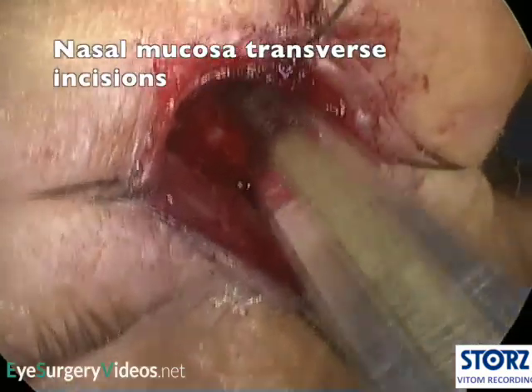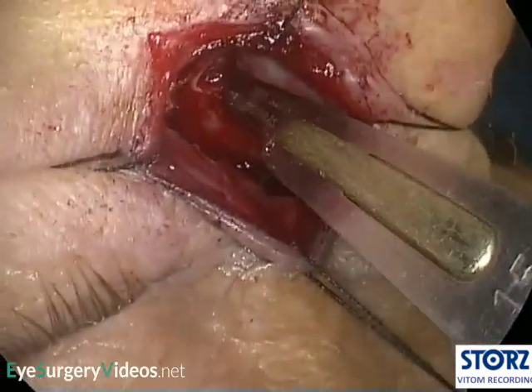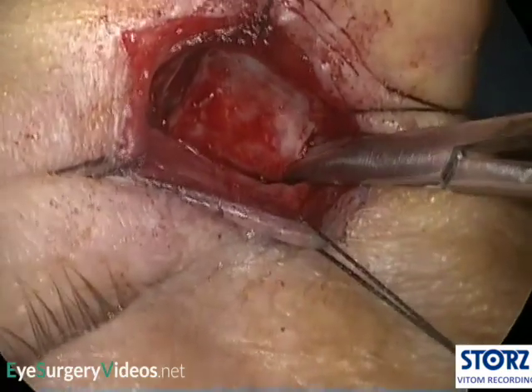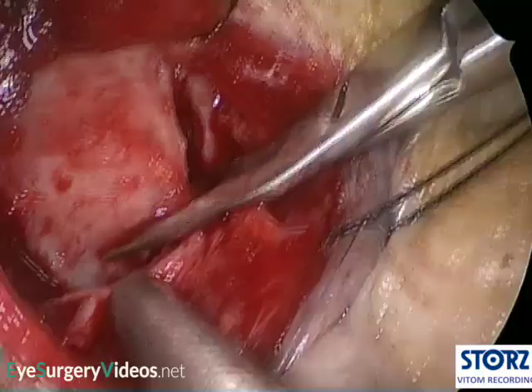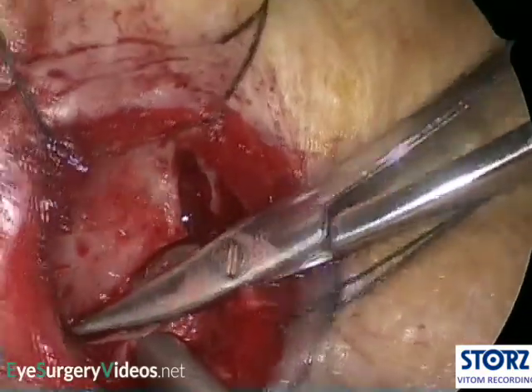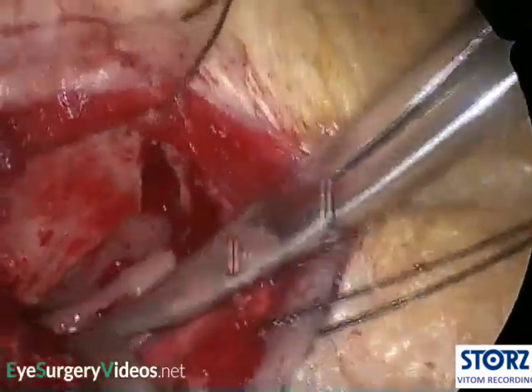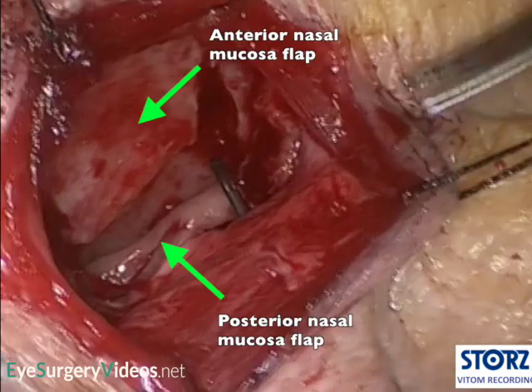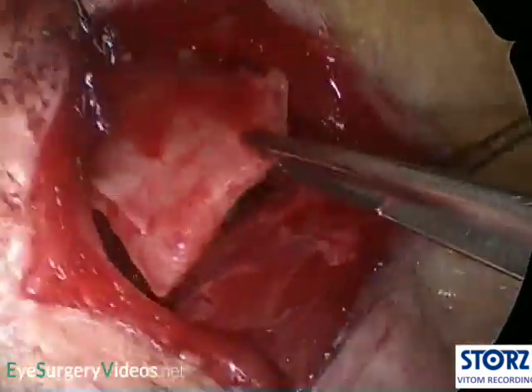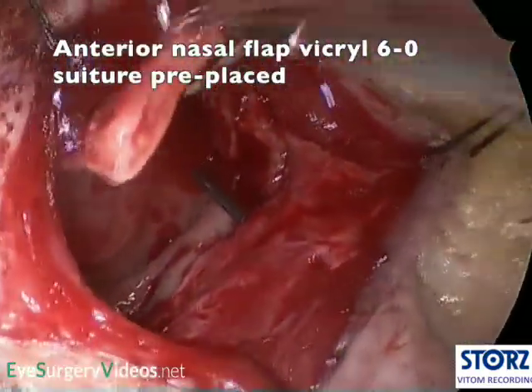Again, a keratome and spring scissors are used to create anterior and posterior nasal mucosa flaps with a central longitudinal incision and a horizontal incision at the top and bottom, rather like a capital letter I. With experience, one can estimate how big a posterior flap will be required to approximate with the posterior lacrimal sac flap and make the longitudinal incision accordingly. The posterior lacrimal sac and nasal mucosa flaps are laid down and their size checked. Occasionally, the posterior nasal mucosa will need to be trimmed to allow them to oppose neatly.